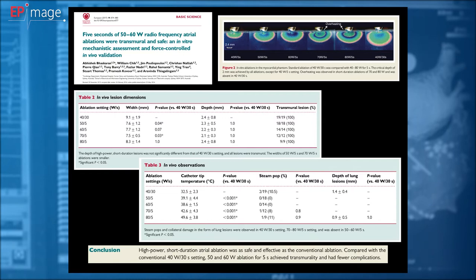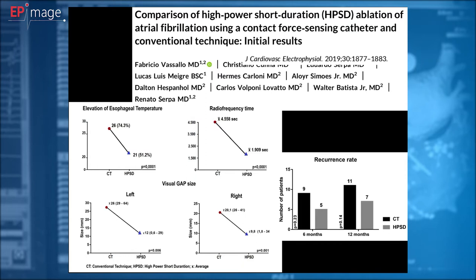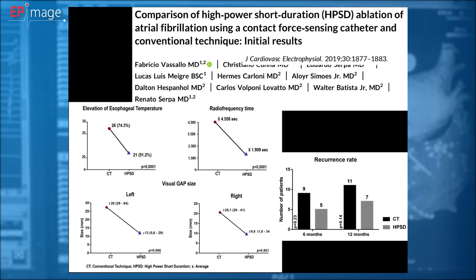There are more and more proofs nowadays that high power ablation with 50 watts is feasible, safe, fast and effective, like reported in this paper where the authors ablated with 50 watts based on the ablation index. Or just another paper comparing high power ablation of atrial fibrillation to conventional approach, where arrhythmia recurrence rate was much lower in the group treated with high power energy. There were much lower number of visual gaps, shorter radiofrequency time, and much lower numbers of temperature alerts on esophageal probe.